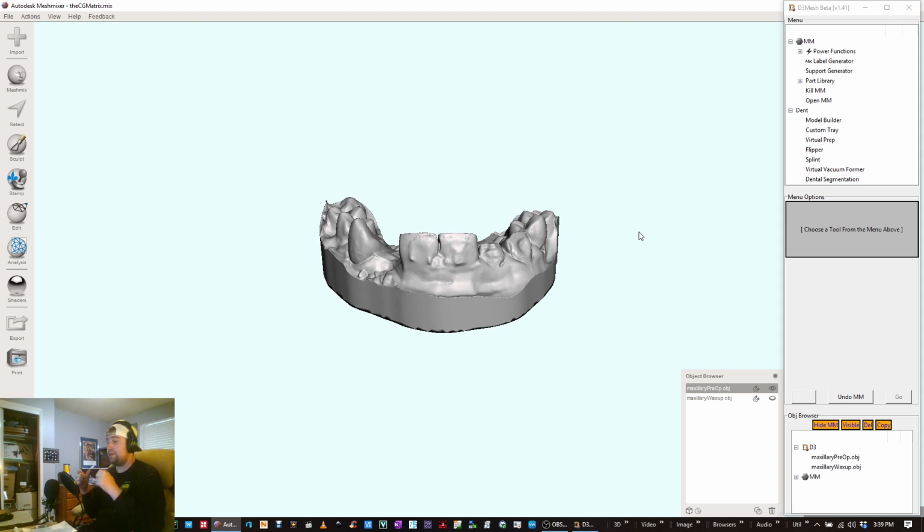Once he did that, he had all these little mylar bands ready to go to insert into those little scalpel slots, so that when he did this kind of injection mold wax up technique, it wouldn't bond the teeth together. All of it was brilliant. So I kind of alluded to the point, I guess. He took this guy's reduced dentition, and he had this Essex type matrix that he then placed over the reduced dentition. I think he acid etched and bonded, maybe beforehand or with the tray on. I can't quite remember which one. Probably before, and then put the tray immediately on right afterwards.